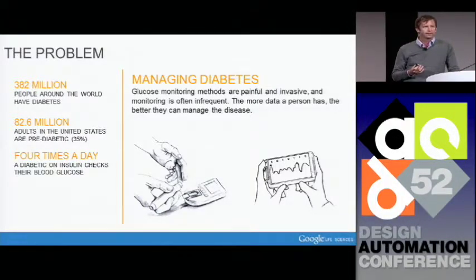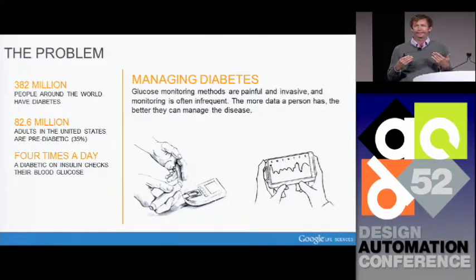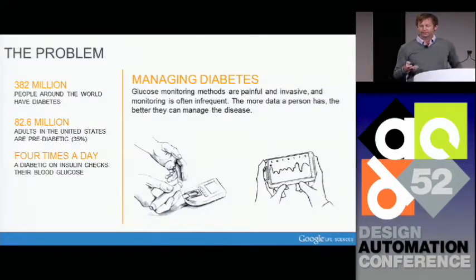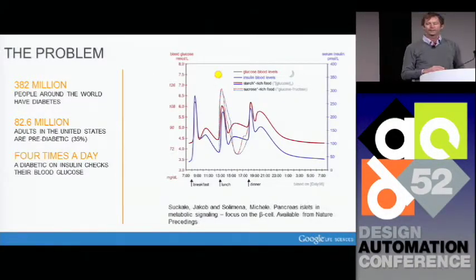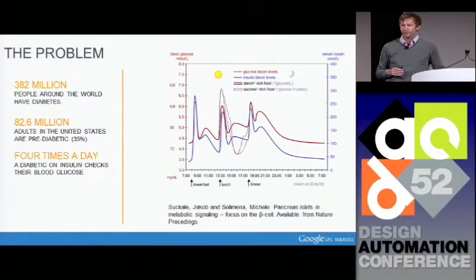The concern is that one of the important ways of trying to manage this disease, if you have type 1 or type 2 diabetes, and one of the ways of trying to either delay or altogether prevent the onset of diabetes, is having access to one very important piece of information, and that is your blood glucose information. Blood glucose changes extremely quickly throughout the day, as shown on the next slide. Here's an example of a healthy person, and you can see that their blood glucose levels could double throughout the day after meals, et cetera. A person's body produces insulin that meets the glucose that allows you to process it, but there are very wide fluctuations throughout the day.